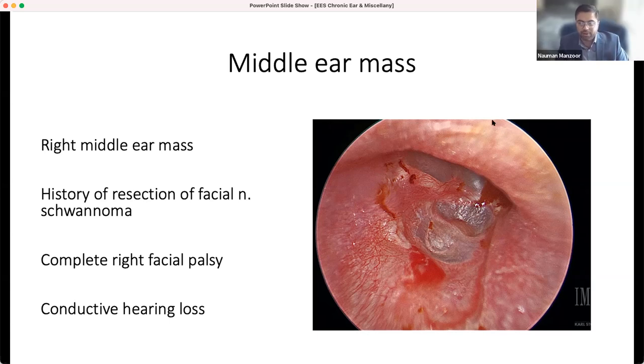While we are on this point, let me ask you guys a question. Do you guys ever divide your flap? Like when you're elevating a flap, in a tighter situation, if the ear canal is smaller? So for example, let's say there's an anterior perforation, and it's the same perforation you showed in the last example. You've elevated off, and instead of elevating the entire drum in one huge plane, once you elevate the annulus, do you sometimes divide the flap through the annulus and just have two leaflets?